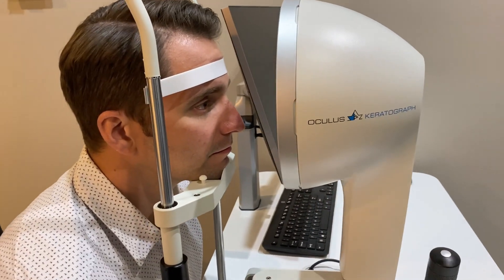There are many other ocular surface analysis systems on the market, and I'm just sharing what I have in my clinic. There are excellent systems that do very similar acquisitions with user-friendly software, such as the IDRA from Clarion Medical Technologies. Whatever system your eye doctor has will provide invaluable information. I even used my cell phone to capture images just eight months ago, and it still did wonders for educating my patients. Pictures are certainly worth a thousand words, and the Keratograph 5M has made it easy, time-efficient, and high quality.